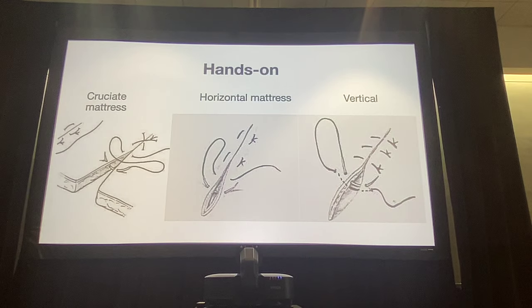The easiest answer is any surgery technique will have options in there for you. However, if you can turn that circle into a spindle shape instead, because the ideal shape is a nice spindle-shaped, elliptical incision. If you can cut the corners off both ends of the circle and make it more spindle shaped, then you can avoid having dog ears at the end, and your closure becomes a straight line. It's going to be a longer incision, but you're improving the cosmetics of it and probably minimizing tension.